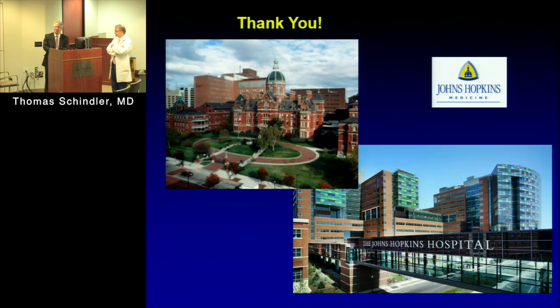yes, for plaque imaging, of course, you have infiltration of macrophages in the plaque, and with fasting FDG PET, you can see it. But the FDG signal in the plaque, at least that conferred by macrophage uptake of FDG, did not prove to be predictive enough for clinical use. So that's why now you have other tracers, sodium fluoride, which is promising, but also here in stable coronary disease it was not promising.